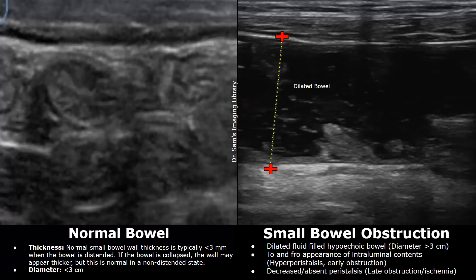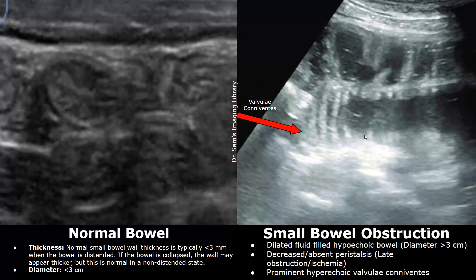During late obstruction or ischemia, you may find decreased or absent peristaltic movements in a dilated fluid-filled bowel. This is another case showing small bowel obstruction — a dilated fluid-filled bowel with absent peristalsis, indicating late obstruction or ischemia.